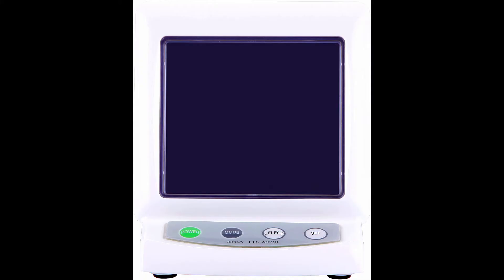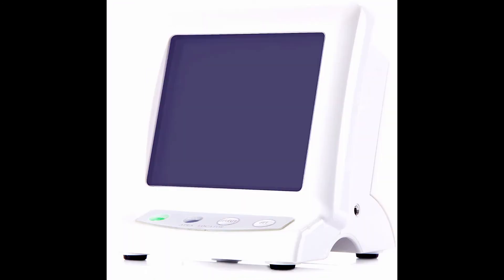ProDENT Dental Endodontic Apex Locator Endodontic Root Canal Finder — White. Product description: ProDENT Apex Locator is easy to clean with a slick design, adopting a flat switch and without scraggly surface, making it easier to clean. Battery power shows through a club-shaped chart indicated on the LCD screen.